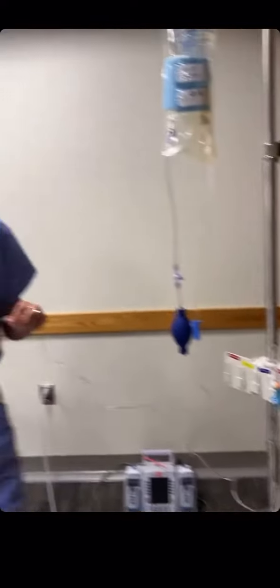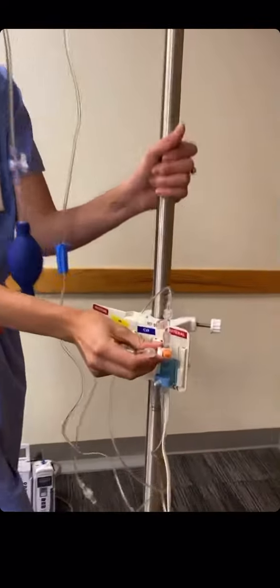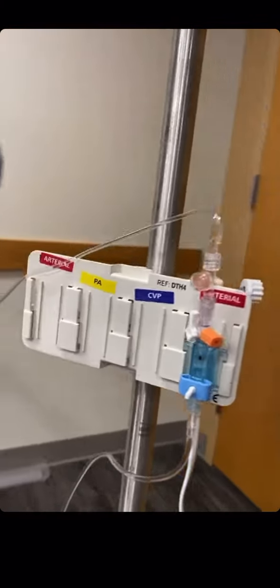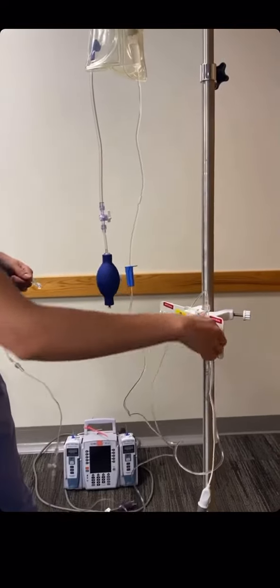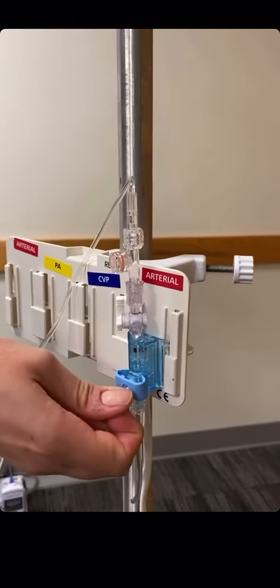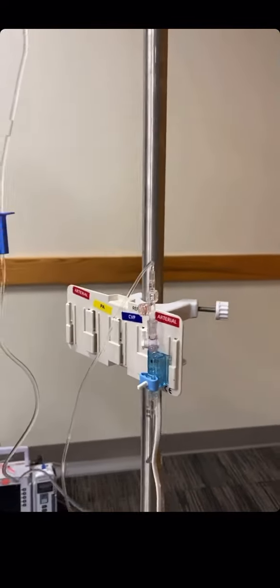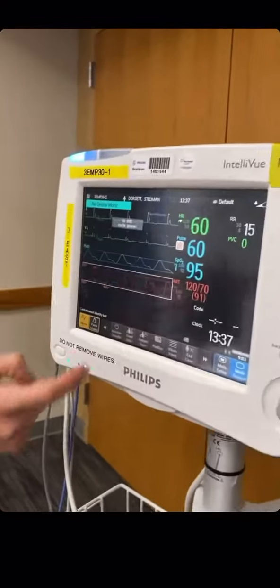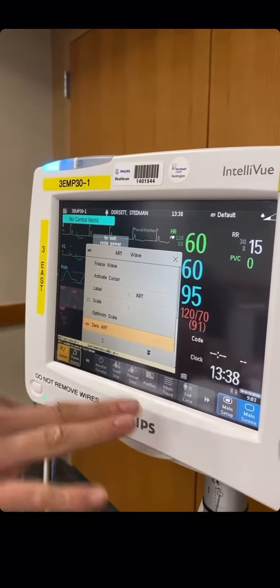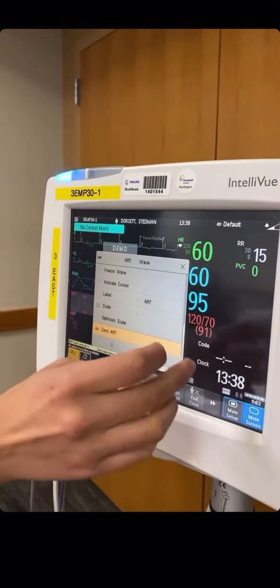Once we're ready to zero it out, we're going to zero it to an area where there's no pressure — we're going to zero it to air. So we're going to flip our stopcock up, and it's going to be off towards our patient, which is at the end of the line. We're going to open our cap like this, pull our tab so that fluid flushes through. Then we're going to head over to our monitor, click the screen, and hit zero arterial line. At this point on the monitor you will see a flat line with a number in parentheses that will say zero.